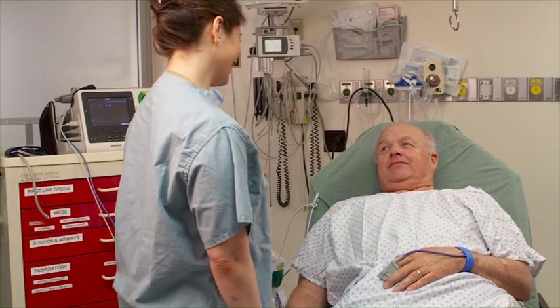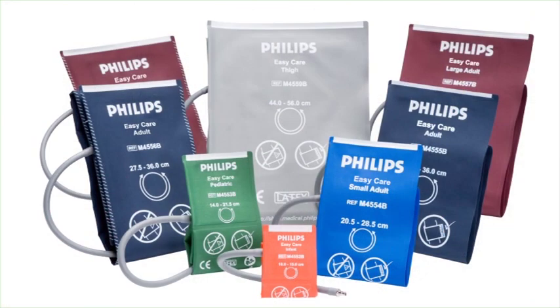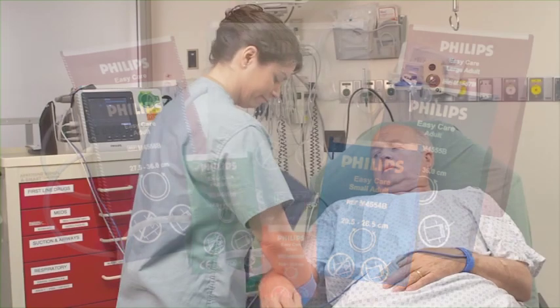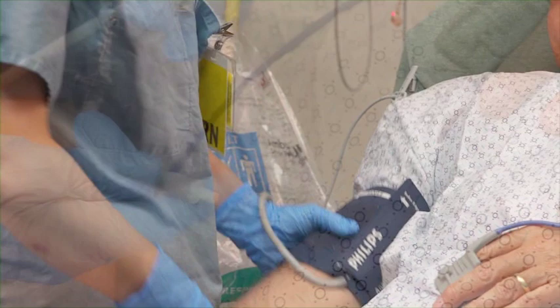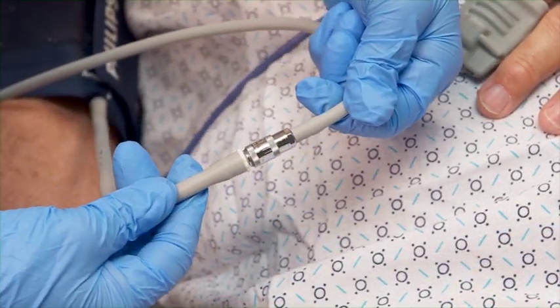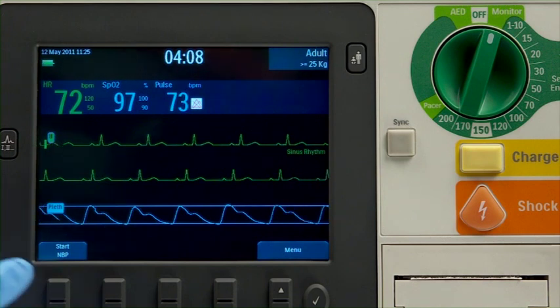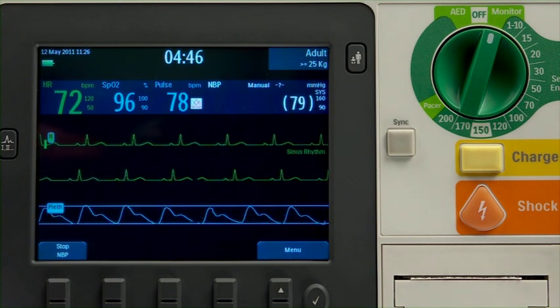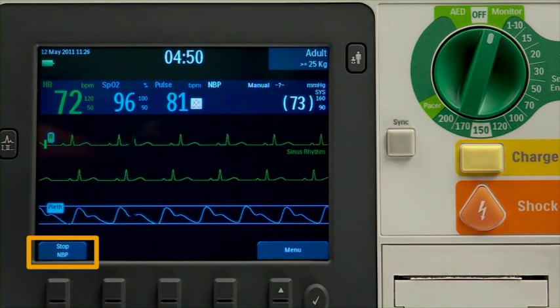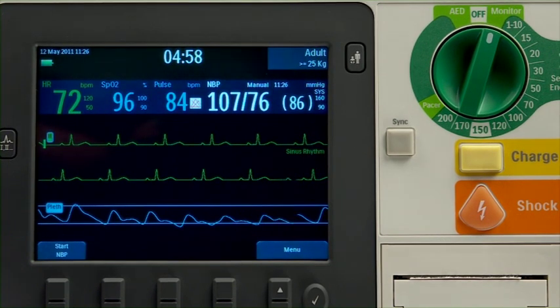The XL Plus can also monitor non-invasive blood pressure. The measurement can be done automatically or manually. The first step is to select the appropriate size cuff. A properly sized cuff should span approximately two-thirds of the distance between the elbow and the shoulder, and wrap around the limb meeting in the indicated area. Attach the cuff to the tubing, and the tubing to the NBP port on the side of the XL Plus. To perform an NBP measurement, press the Start NBP soft key. The cuff inflates and then slowly deflates. If you need to stop the NBP reading, press the Stop NBP soft key. The NBP measurement appears on the screen as systolic followed by diastolic with a mean arterial pressure in parentheses.